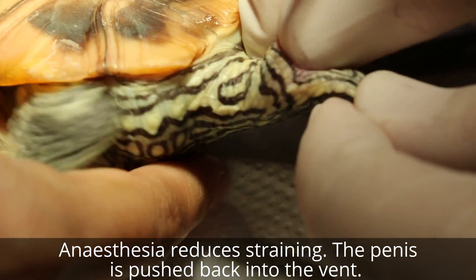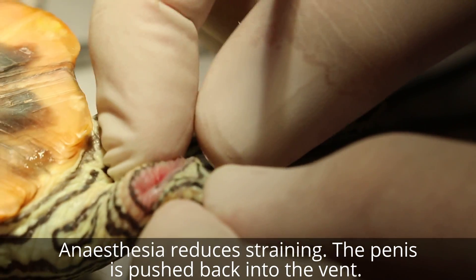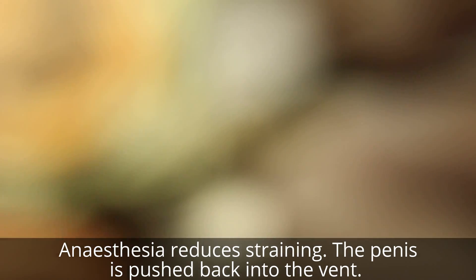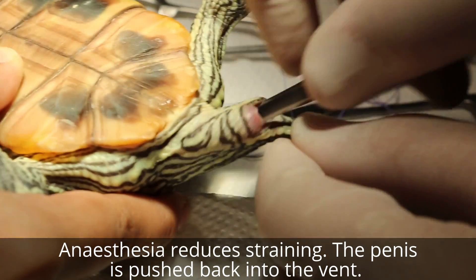So once it goes in, I will stitch up here - it's called a purse-string suture, a purse-string suture because it looks like a purse string. So I push it in as much as I can. This is the penis.